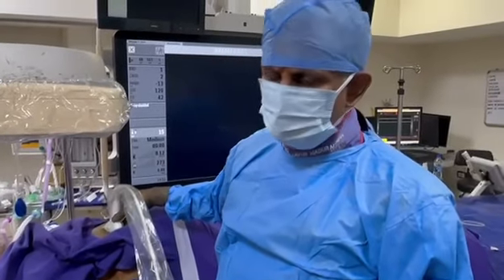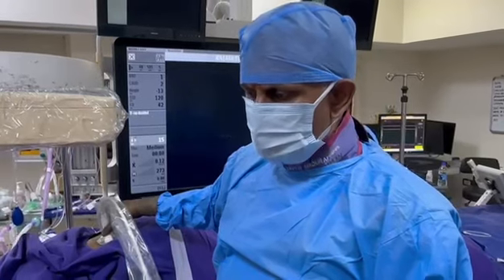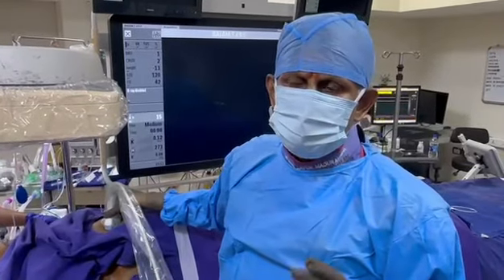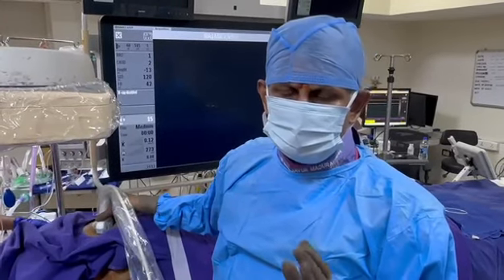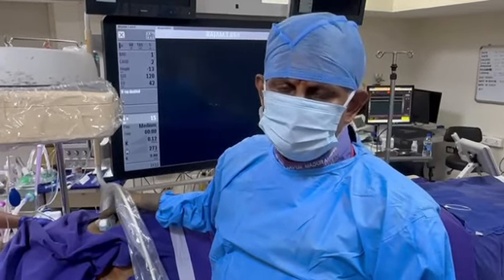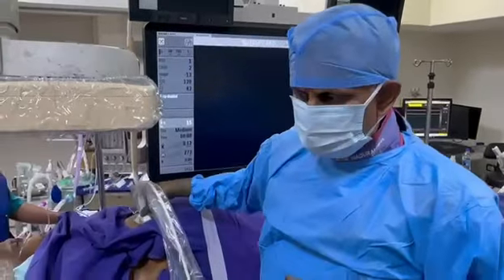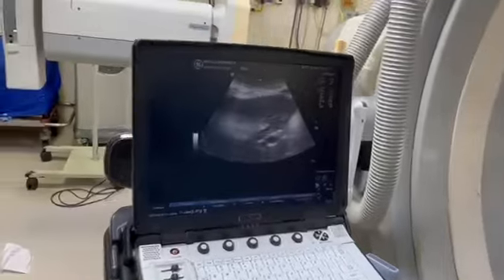a percutaneous drainage. So before going in aggressively for a drainage, we need to see which system is dilated. Is the right, segmental, left, or both systems? So it will help you to plan the procedure much better. So since it is a cholangitis, I would like to use as minimal contrast as possible.